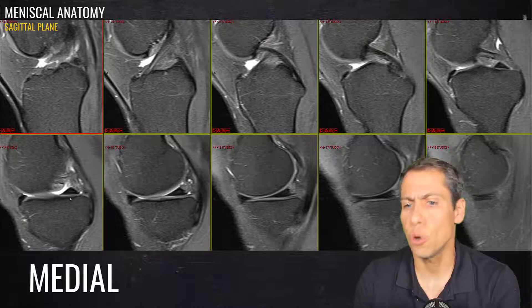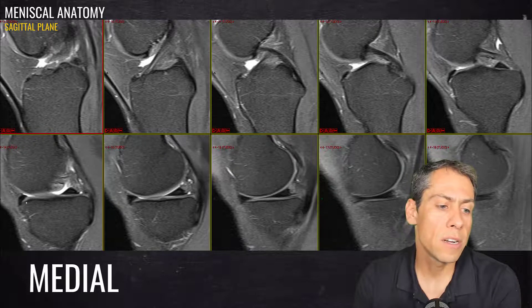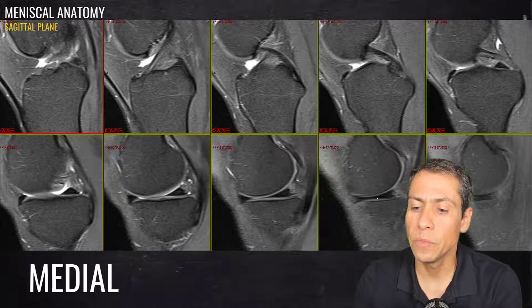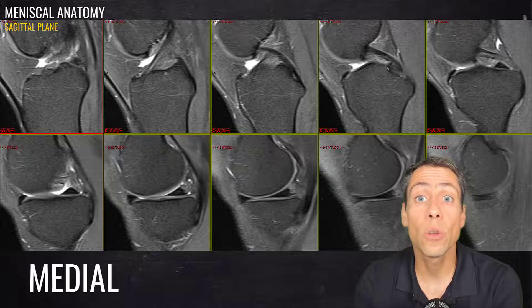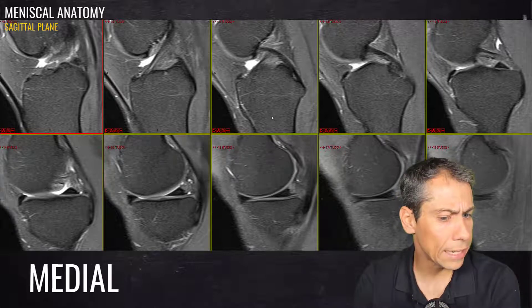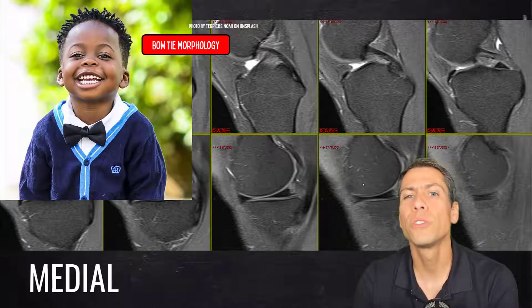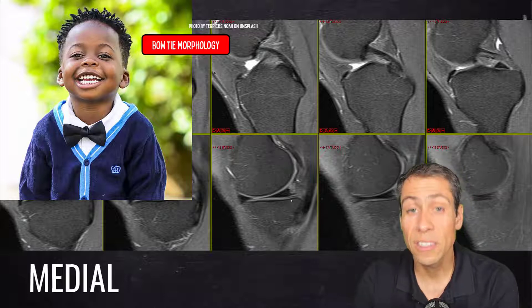Now I'd like to show the normal meniscus on the sagittal plane. We can see the anterior horn and the posterior horn on the short axis, and the meniscal body on the long axis. Here is the anterior meniscal root ligament, and here is the posterior meniscal root ligament — I'll save root ligaments for another video. We can appreciate the classical bowtie morphology that we see on MRI of the knee when analyzing the menisci on the sagittal plane.